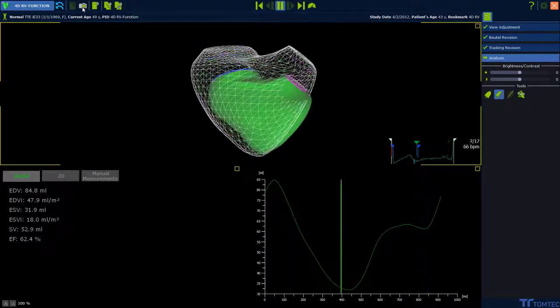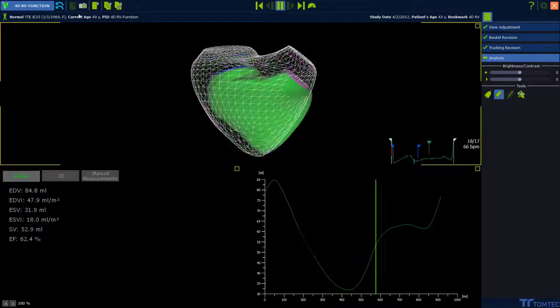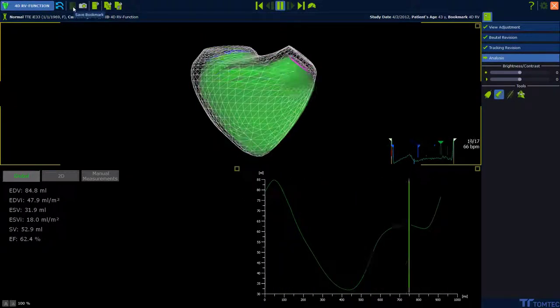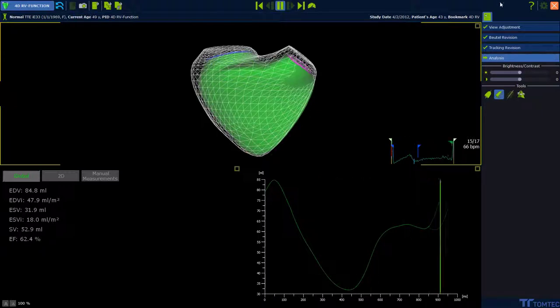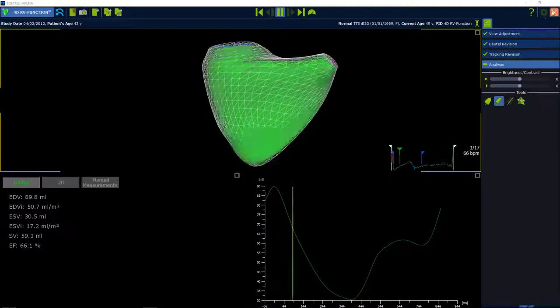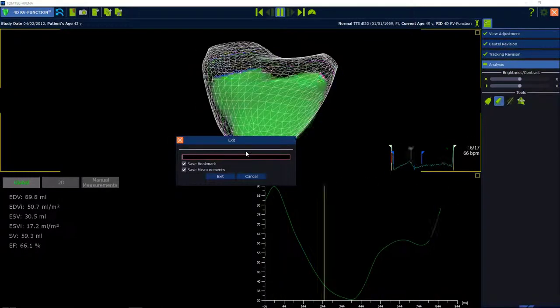The last button on the left side is for creating a bookmark. We can also create a bookmark if we exit the application on the right upper corner. Type a name to relaunch it later on.